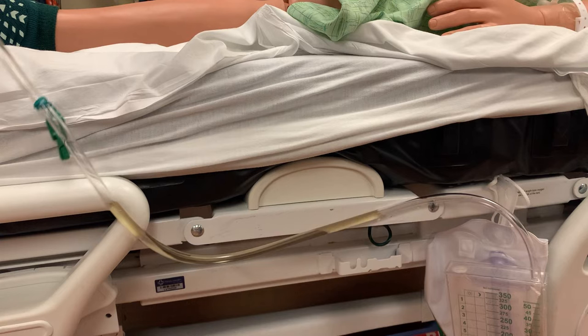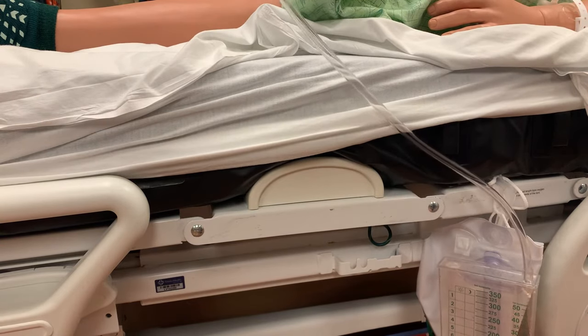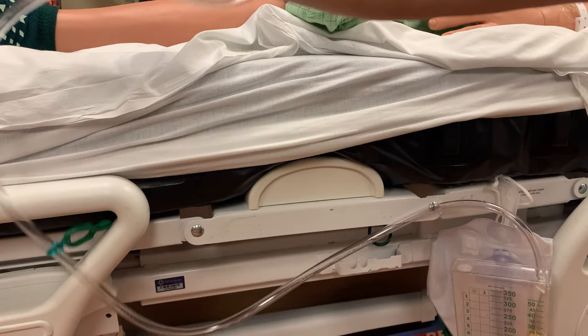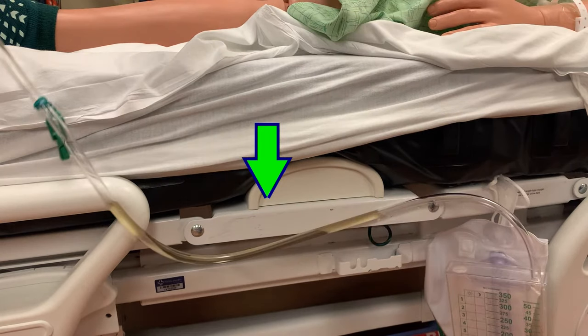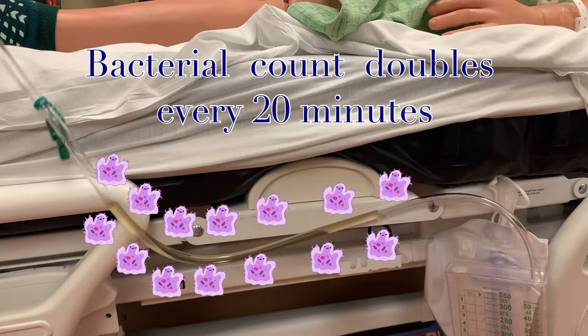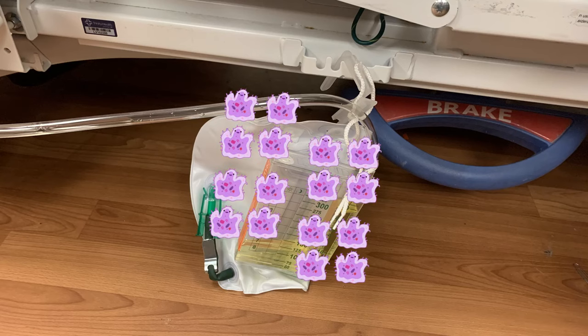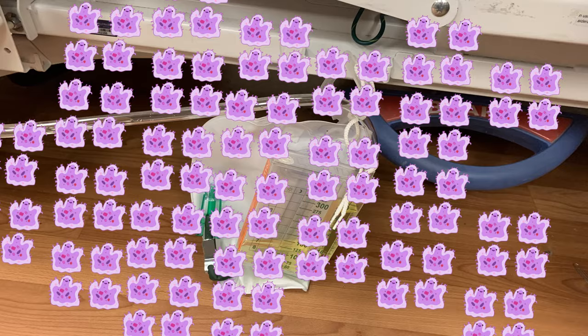Before you collect the urine sample, first clear the tubing of all urine that may be sitting in it. The urine you collect should be as fresh as possible, so we don't want to use anything that has been sitting in the tubing for an unknown amount of time. Bacteria in urine doubles every 20 minutes, so it is important that the sample is collected as soon as we have enough urine to send to lab. This is also why we can never collect urine samples from the collection bag itself.